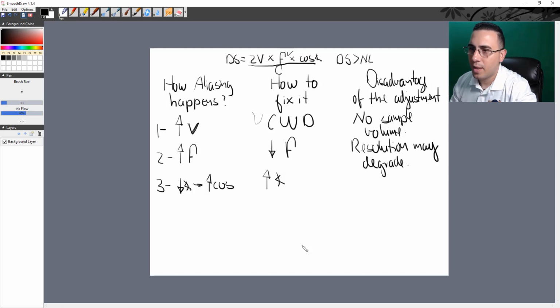So the problem with going with a high angulation is not-too-accurate velocity measurements.